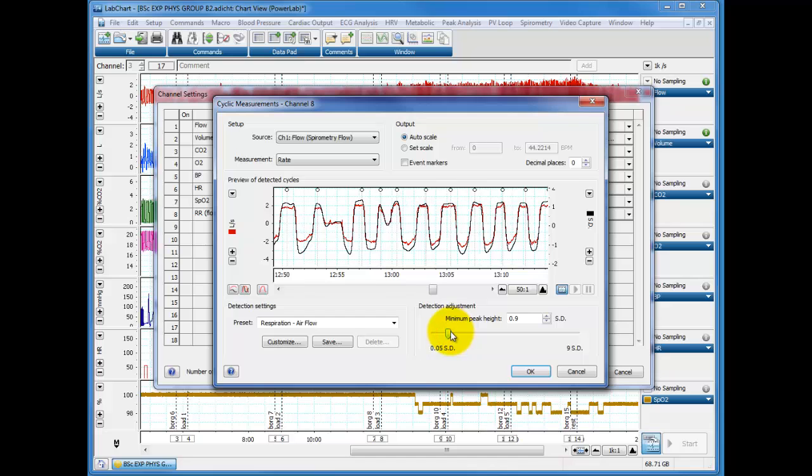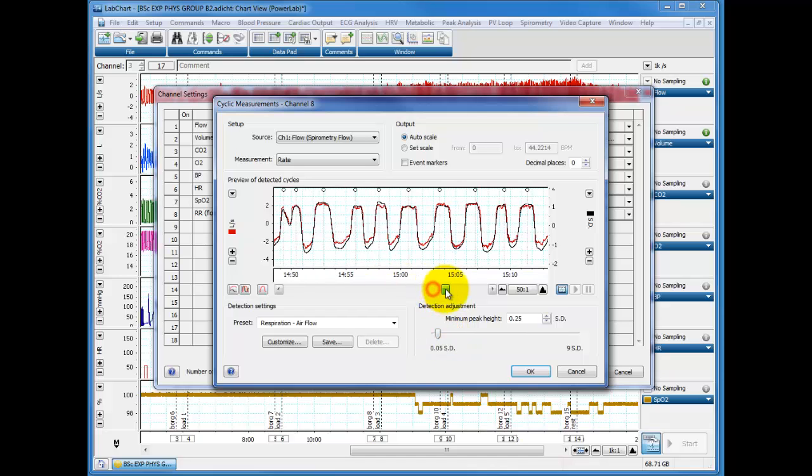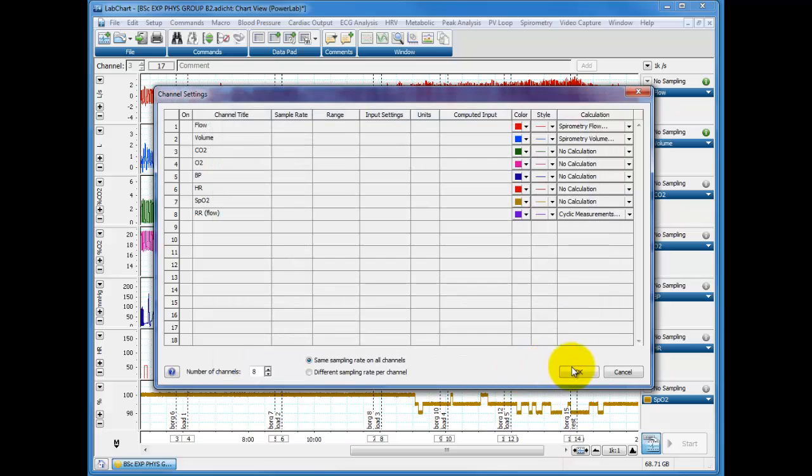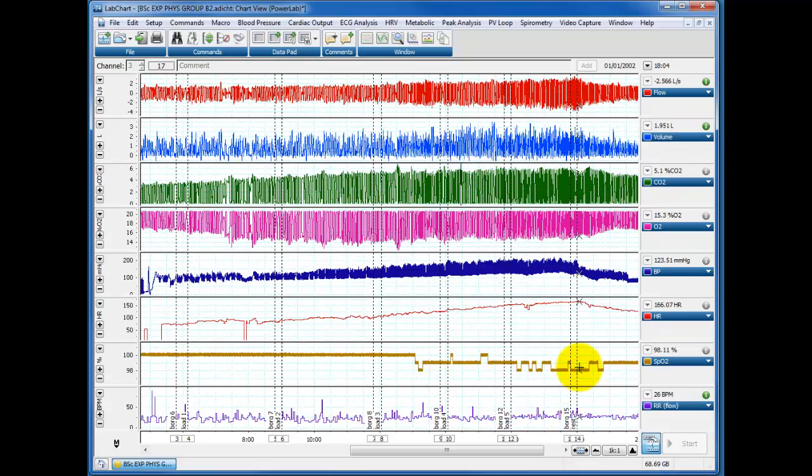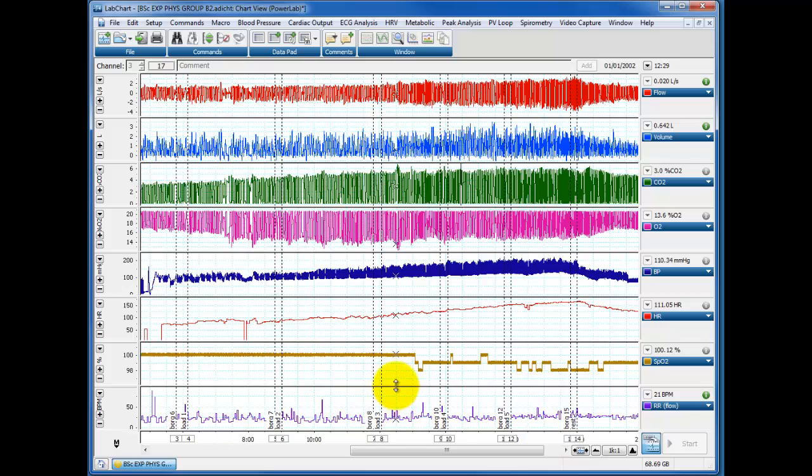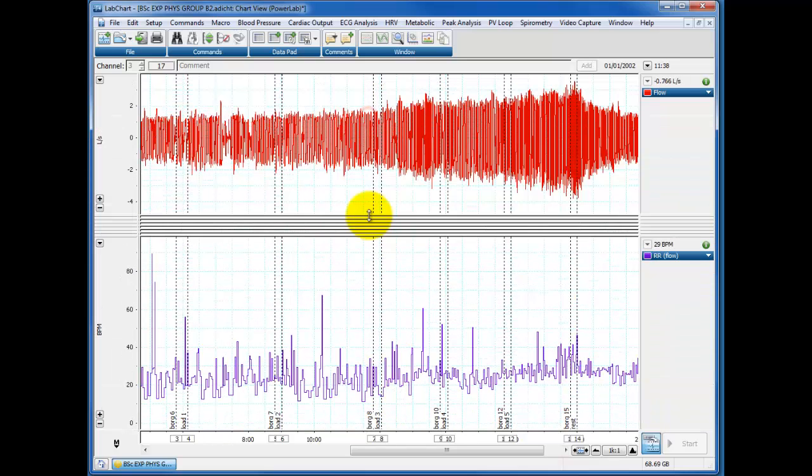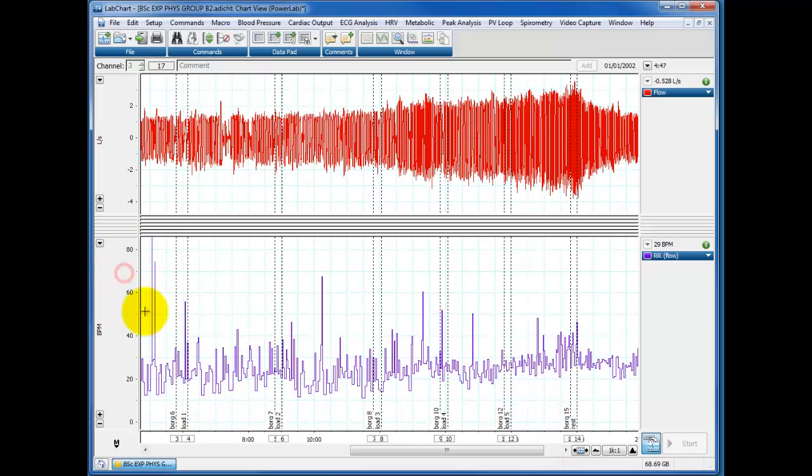You could adjust this of course and try and smooth it out but I think that's pretty good. You can see it's actually quite variable. This respiratory rate isn't stable so we're expecting to see some variation. So we click on OK, press OK here and there is our respiratory rate down the bottom. So let's just zoom in on that and you can see as predicted it's quite variable.